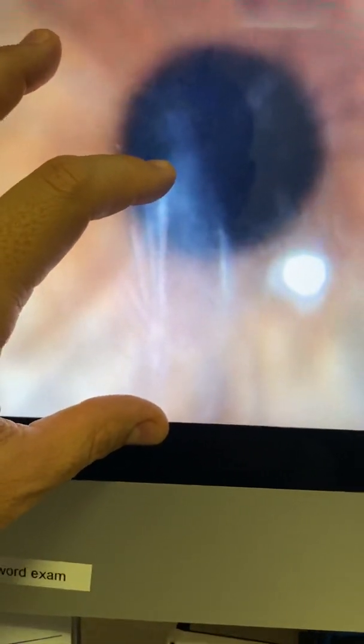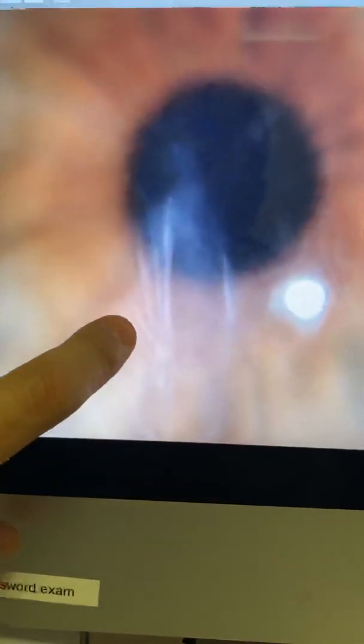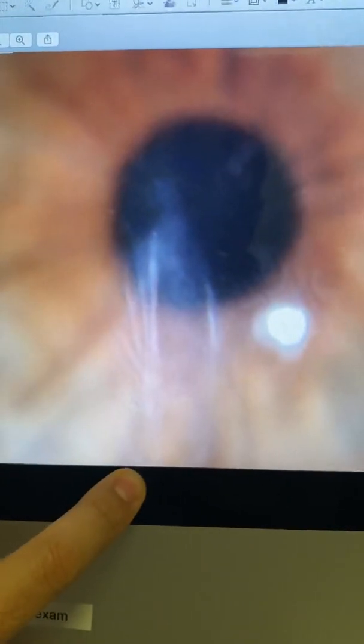We're seeing here he has a recent history of hydrops, and we're seeing the very remarkable and very long split in Descemet's membrane. This is over 5 millimeters. It is vertical, and we can see that Descemet's is wrapped onto itself on this side. We're going to come back to this, a very important point. This is the other eye, also with keratoconus, also wearing a PROSE lens.